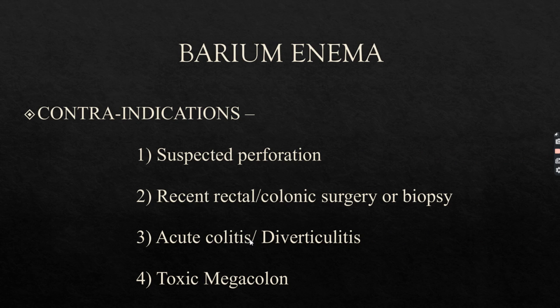Contraindications of barium enema, as usual: suspected perforation, recent rectal or colonic surgery or biopsy taken from this area, either the rectum or the colon, then acute colitis or diverticulitis, and toxic megacolon. These are the contraindications for barium enema.